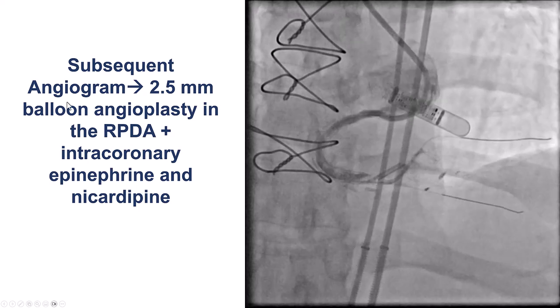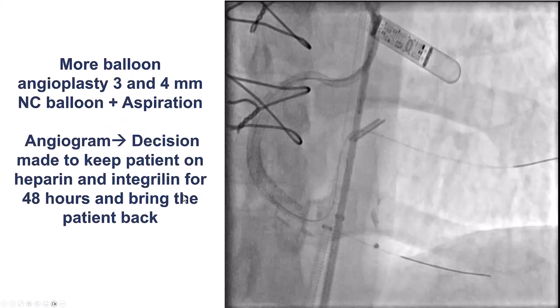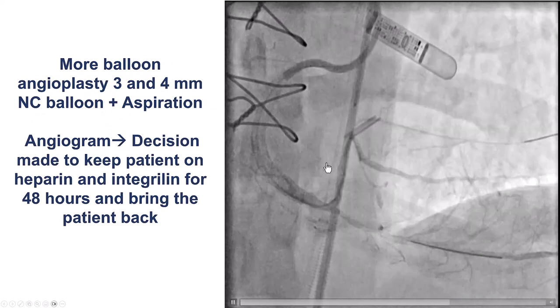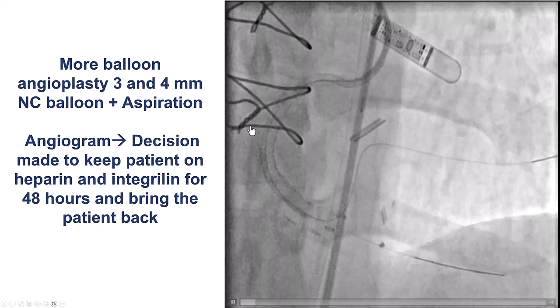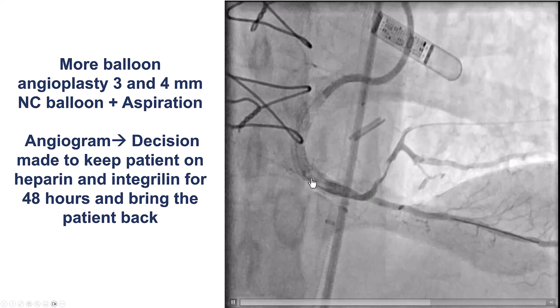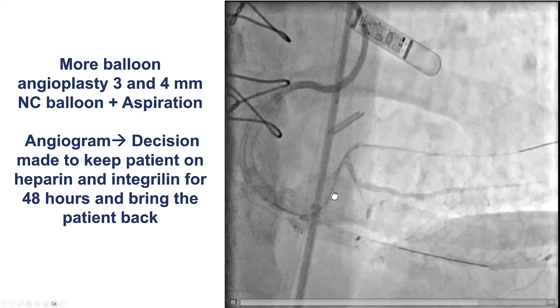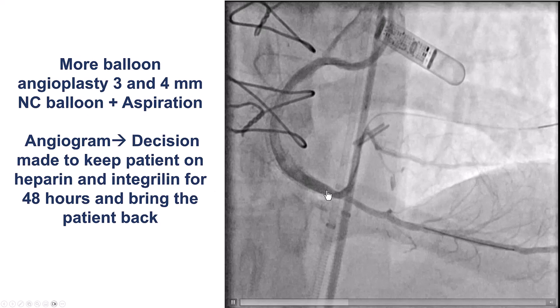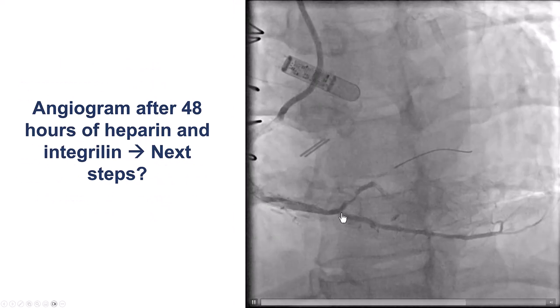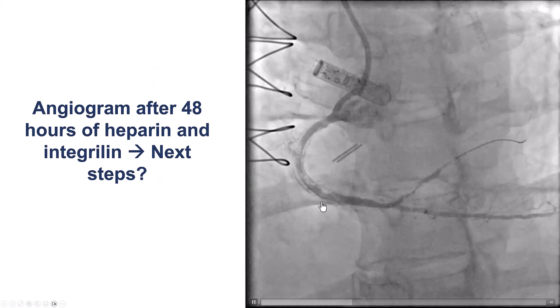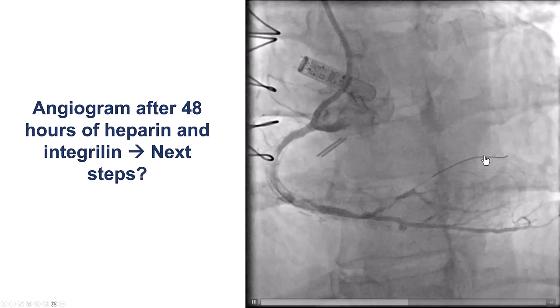We gave intracoronary epinephrine and nicardipine, having already given 2B3A inhibitors, and did more aspirations, but there was still poor flow and large thrombus burden. In cases like this, after many aspirations and pharmacologic treatments, we sometimes let the patient go to the floor on heparin and a 2B3A inhibitor — heparin and eptifibatide — and bring them back two days later. We did that, hoping for a better angiographic image, but to our dismay, there was still a large filling defect and no flow into the right posterolateral.